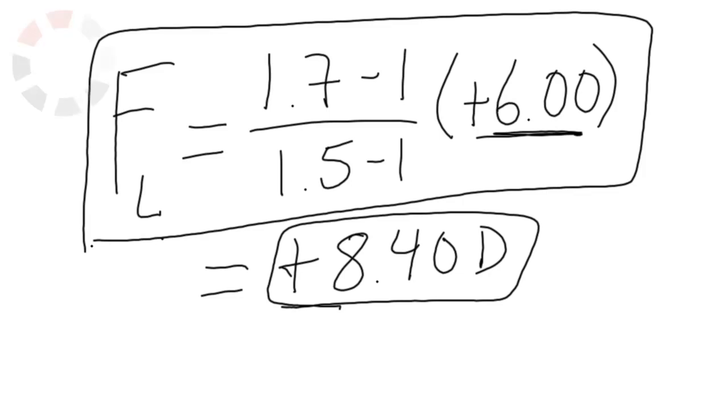We'll clear the whiteboard and move on to our next topic. So now what we're going to talk about is fundus lenses. We're all used to using fundus lenses in clinic, so just a couple of points optically that we want to bring out about fundus lenses. Whenever I'm thinking about fundus lenses here, I would think about your standard 60, 78, 90 diopter lenses. I really wouldn't worry too much about your superfields and superpupils and things like that. The key point that I want you to remember, it's boxed right here in your text, is that higher powered fundus lenses give you lower magnification and increased field of view. So you want to put a highlighter box around that, star that, really important.